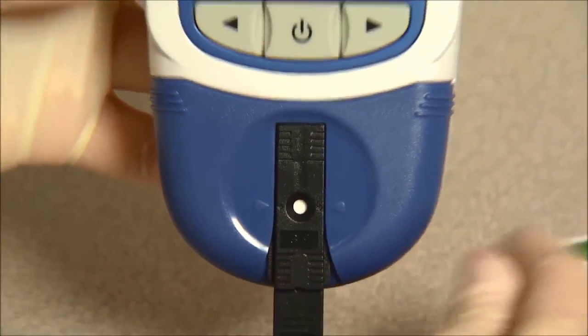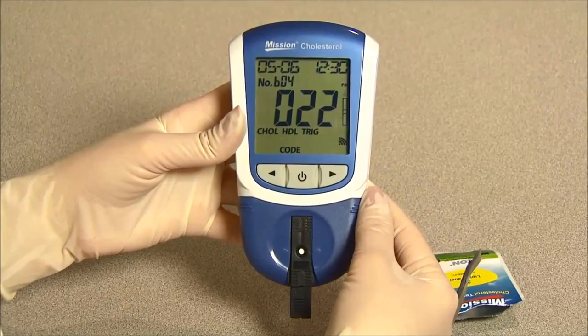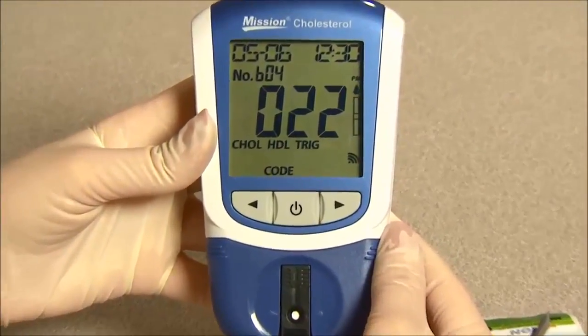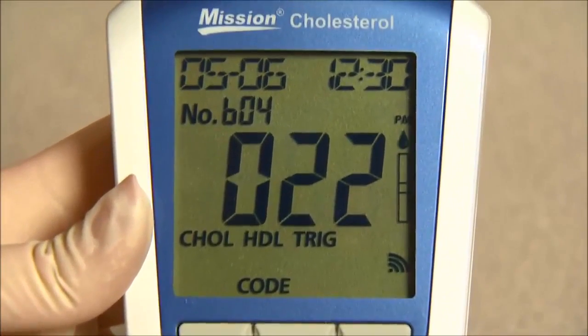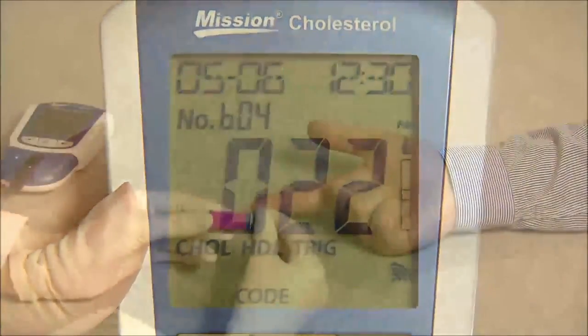The blood drop symbol will flash when the meter is ready for the specimen to be applied. Check that the battery symbol is not visible on the screen. If it is visible, your batteries are running low and you can only perform a few measurements, so replace the batteries as soon as possible.